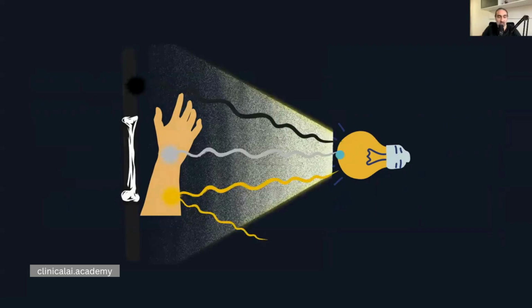So once you turn on the source of X-rays, you can see when they hit the film, they get black. When they hit the object, they get absorbed by the object, so the color of the film remains intact, and some radiation even gets reflected. And that's why if you're performing this examination as an examiner, you need to wear protective gear to protect you from the radiation or even leave the room.